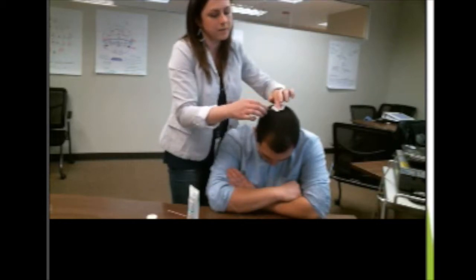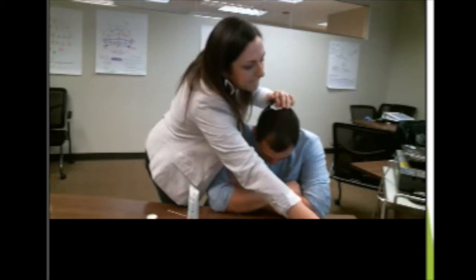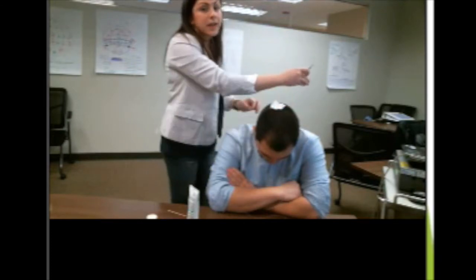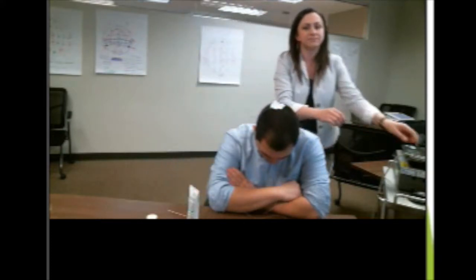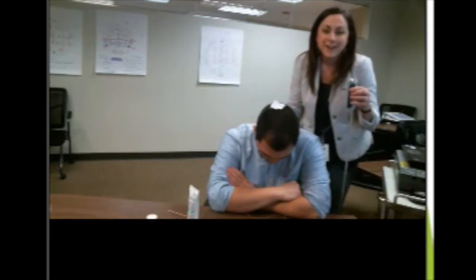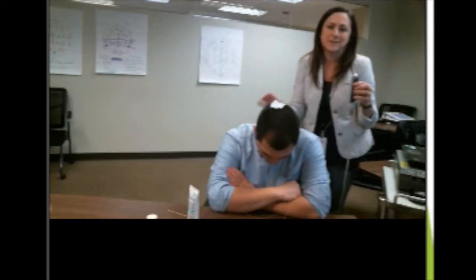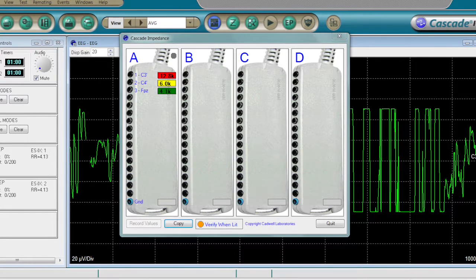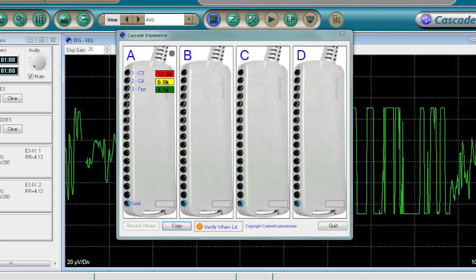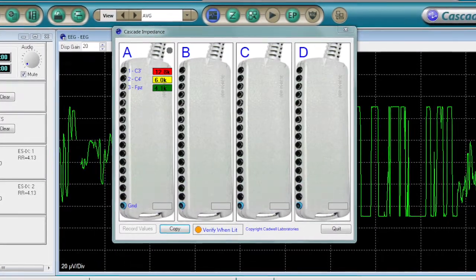Then I'll apply a little bit of pressure and take the edge of my electrode, plug in my electrode, and see what the impedance measurement is. Remember, according to our national guidelines, we need our electrode impedances to be less than five kilo-ohms. As you can see, the electrode that we just placed is measuring an impedance below five kilo-ohms, which is why it shows in green.